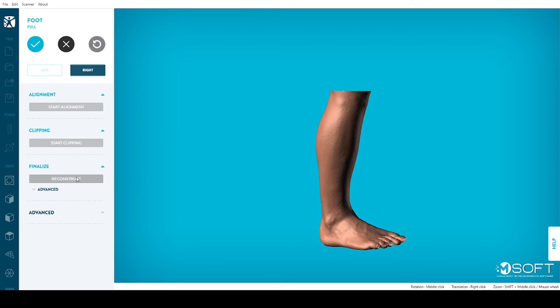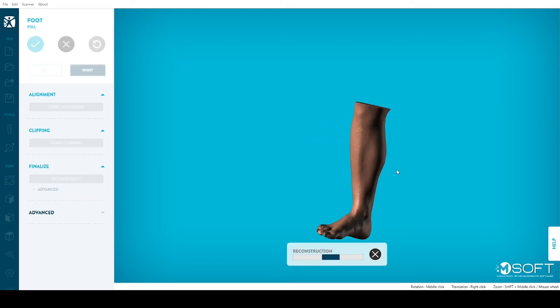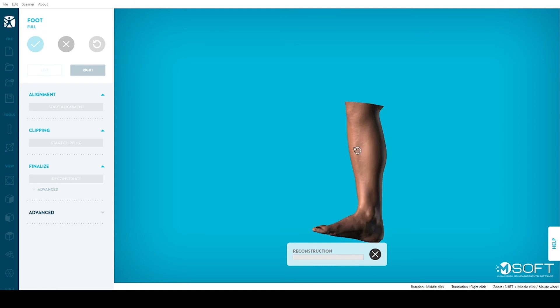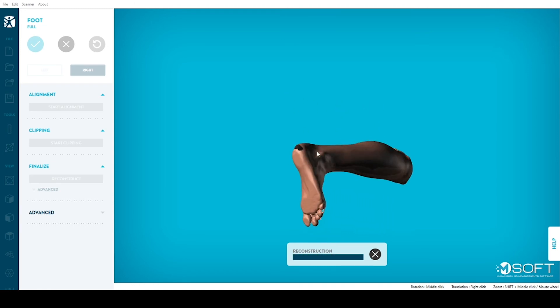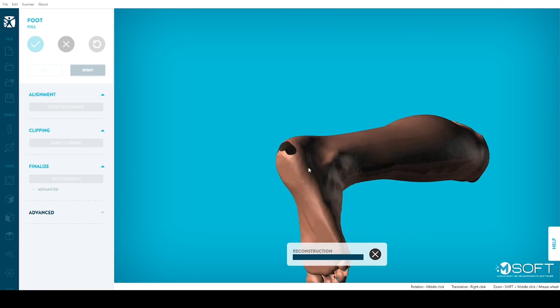Third, click on Reconstruct. Reconstruction is the automatic process in which M-Soft will smooth your model to create a clean, watertight result.